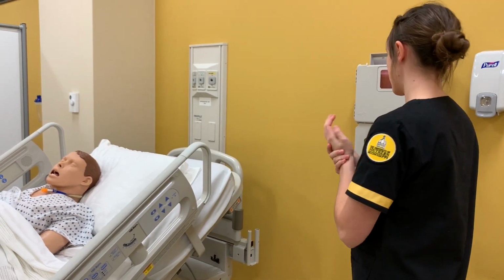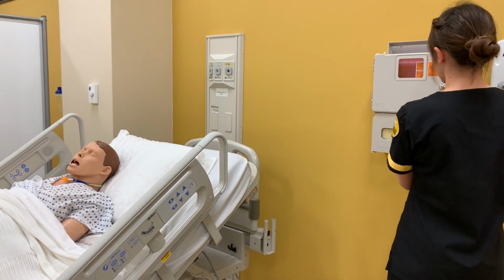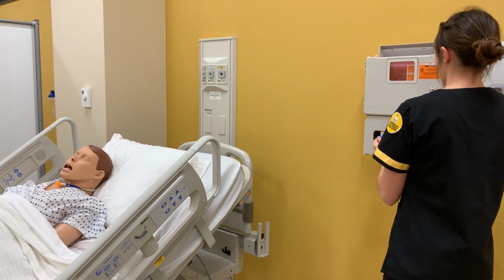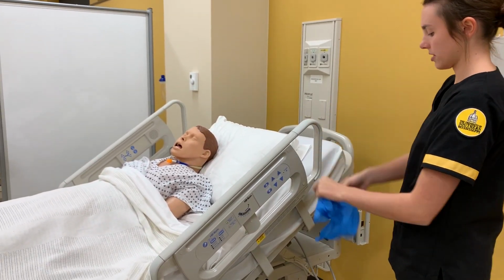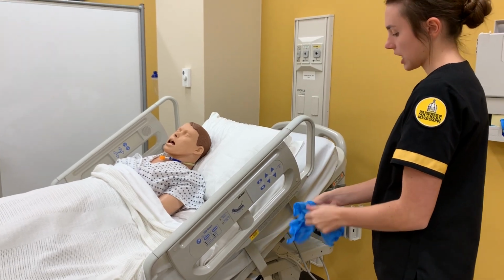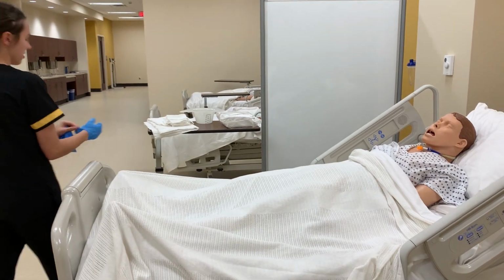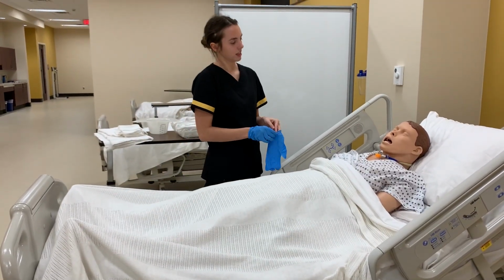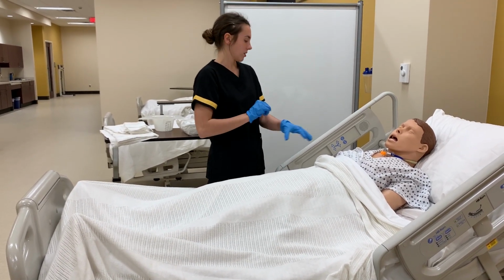Your doctor ordered it since you fractured your hip and can't get up to go void. This is just going to make it easy for you so you don't have to move and have any pain with that hip. So let me get my gloves on and then we can get started. Do you have any allergies? For this procedure, we're just worried about latex, iodine, and betadine. No? Okay, perfect. So here we go.